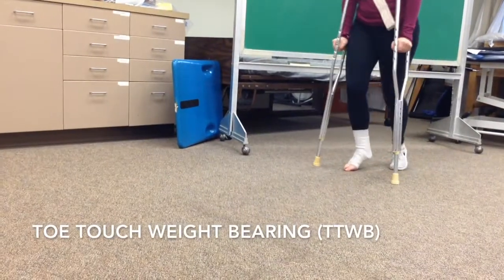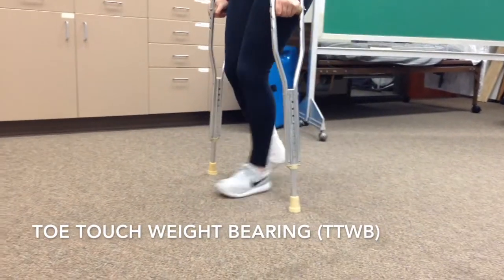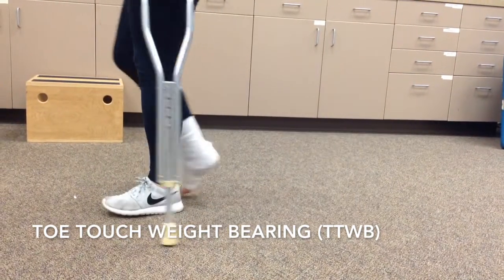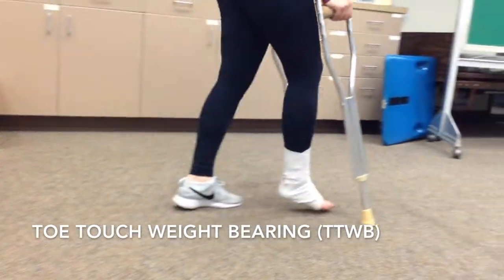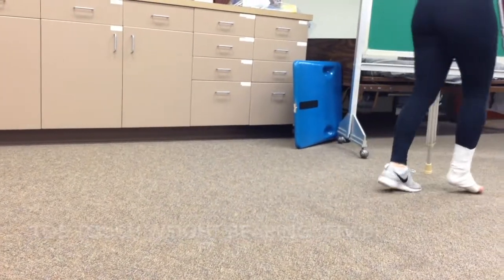Toe touch weight bearing is when the toes of the involved lower extremity are allowed to rest on the ground for balance. The involved lower extremity is not permitted to bear weight. To remind the patient not to weight bear through that toe, tell them that they are stepping on a potato chip that they do not want to crush and clean up later.